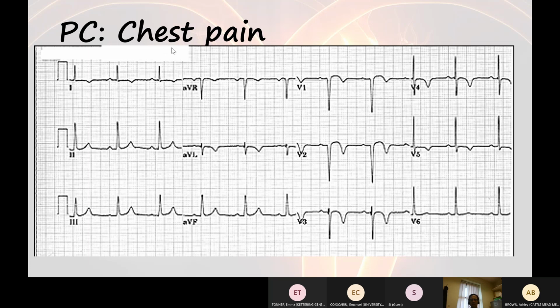So the patient may be presenting with chest pain and this ECG might be unchanged over the course of the last few years. Old ECGs are absolutely critical because you're looking to see if there's been any dynamic change within that. Sometimes inverted T waves can flip upright when a patient is ischemic. So this ECG suggests an old anterior infarct and potential left ventricular aneurysm, and doesn't reflect acute ischemia.